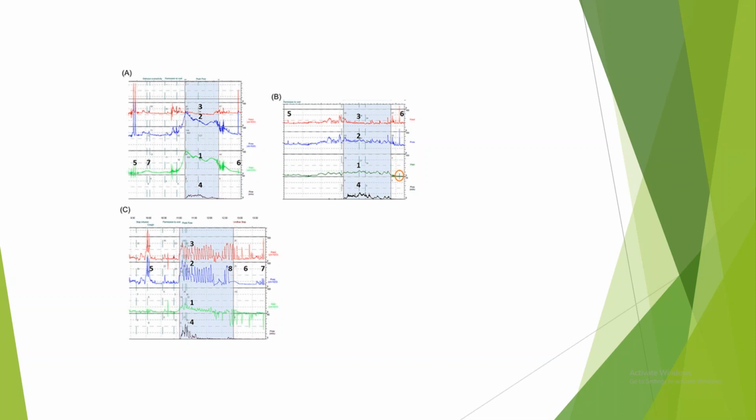So neurologic cause we are not very much concerned. The only thing we should interpret is what exactly it is. We should tell whether it is because of detrusor hypocontractility or because of bladder outflow obstruction, and that this graph is due to repeated straining or Valsalva. If we tell this also, it is okay.